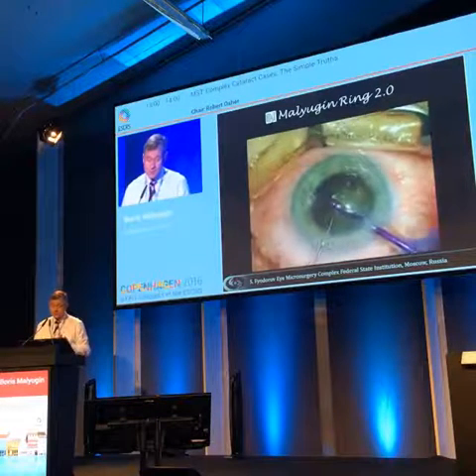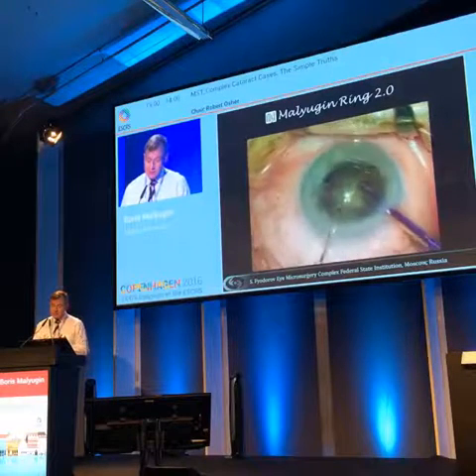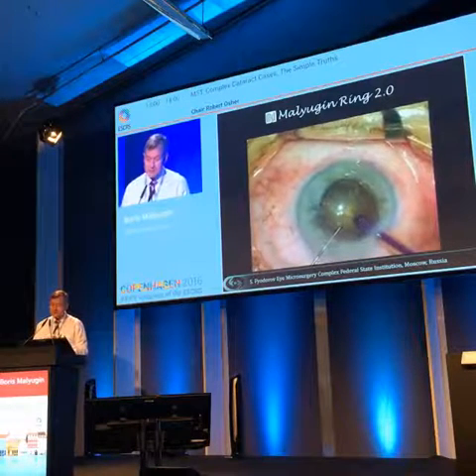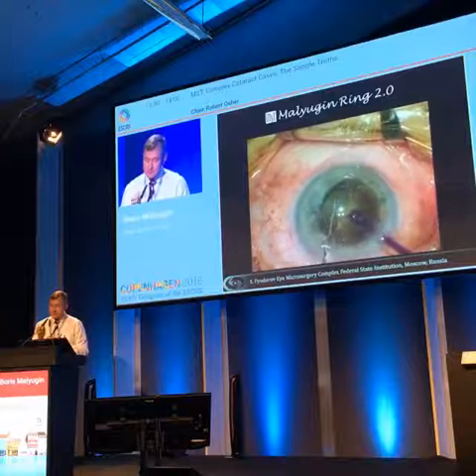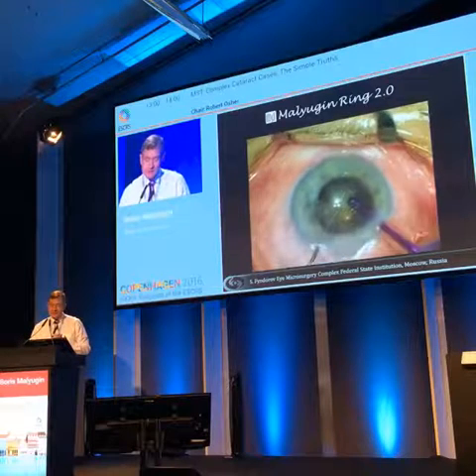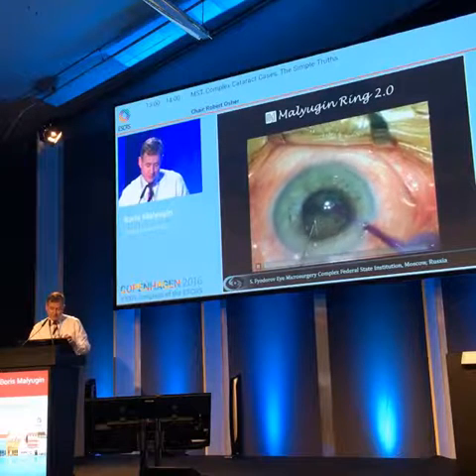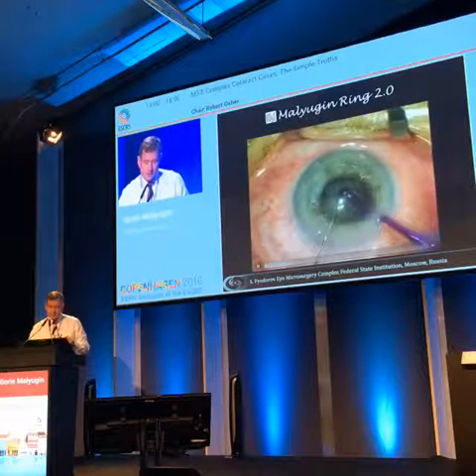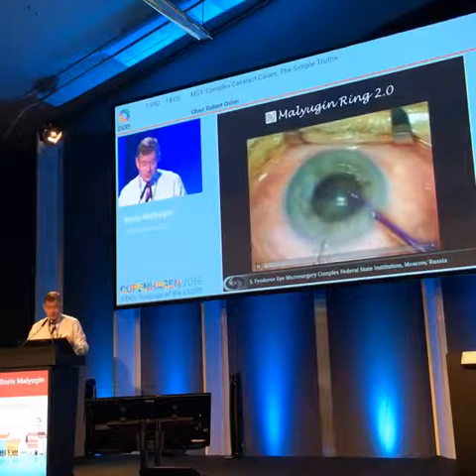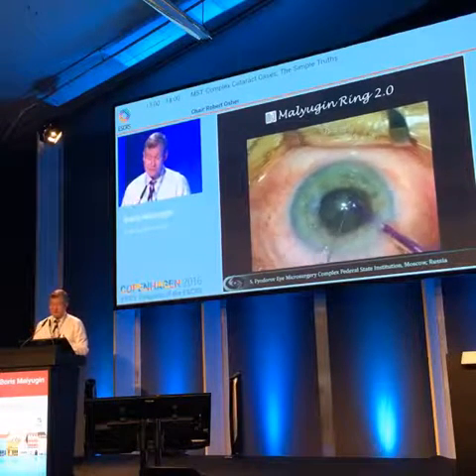So I was doing my routine steps of phaco surgery by aspirating the cortical material, aspirating and cleaning the anterior surface of the lens, and then I try to follow the cleavage planes that were created by laser, following these planes in order to disassemble this nucleus. But look at this paracentesis. So the pupil starts prolapsing through the paracentesis. It starts constricting during the surgery, and this is definitely intraoperative floppy iris syndrome in these patients.